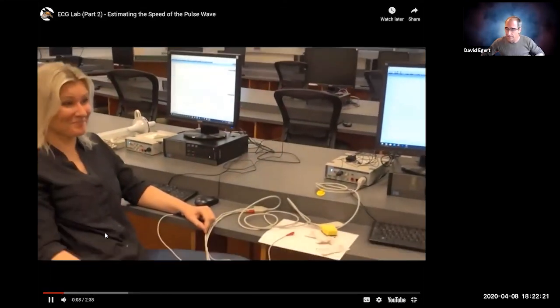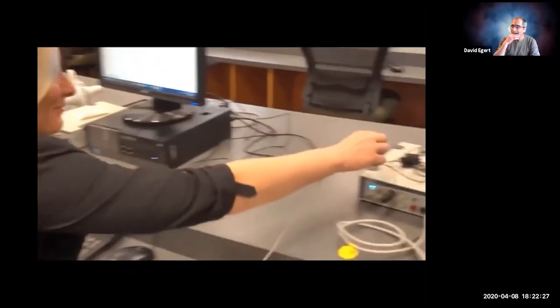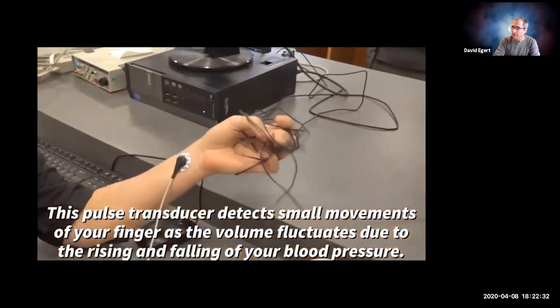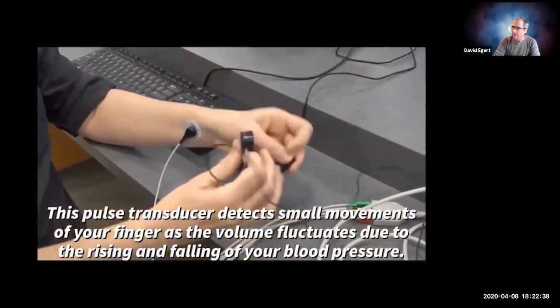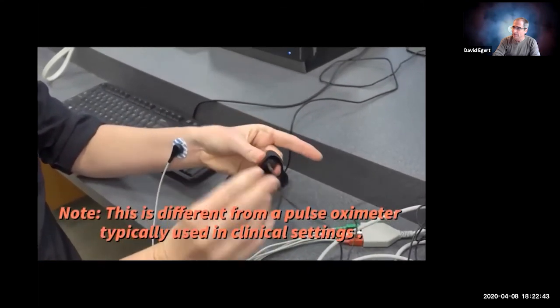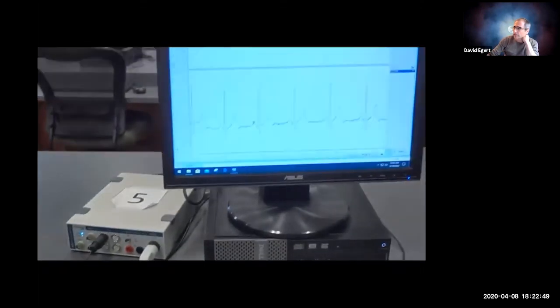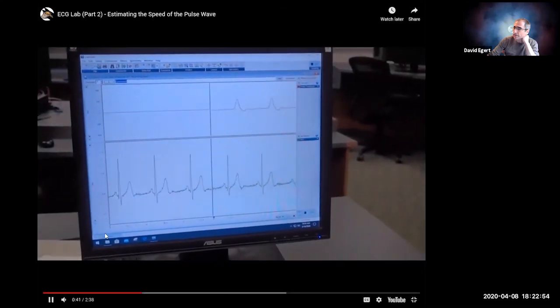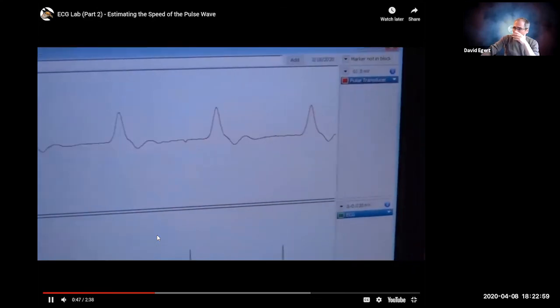All right, so now it's time for the pulse transducer. Wait till all this goes wireless. Just put that on there and have it nice and firm, but not cut off her circulation. I'm going to show a sample. So now start it up again. And I'm going to zoom in.